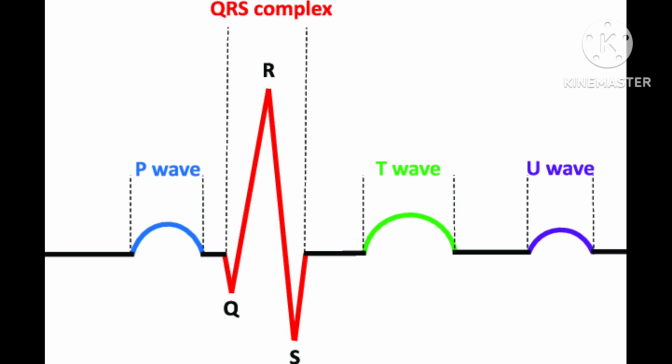The electrodes are connected to an ECG machine by lead wire. The electrical activity of the heart is then measured, interpreted and printed out. This is the main work in measurement. Again I am telling you, the electrodes are connected to an ECG machine by lead wire.